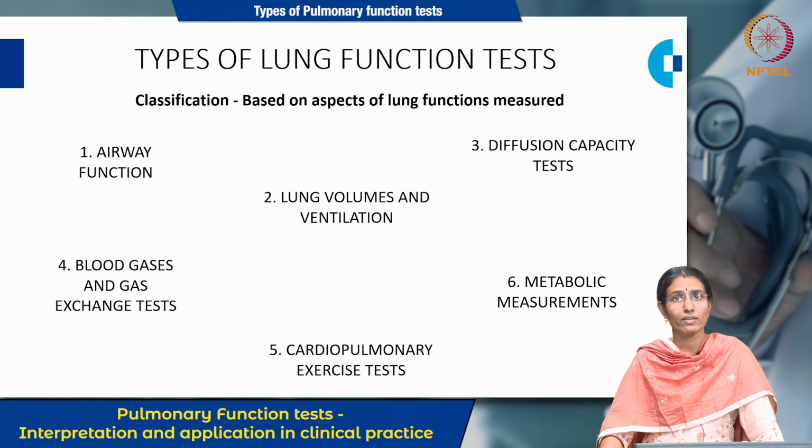So we have seen the different types of lung function tests in this module. The most important one is the test of airway function, of which spirometry is a very important technique which will be done for you in detail in module 5, including the parameters measured using the spirometry technique. We saw the other tests too, like helium dilution and the body plethysmography technique to measure the functional residual capacity, the diffusion capacity of the lung using the carbon monoxide technique, and then tests to measure the gas exchange, and then cardiopulmonary exercise tests, and then the metabolic measurements.